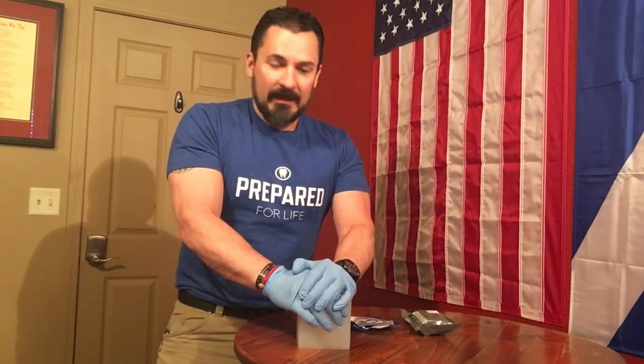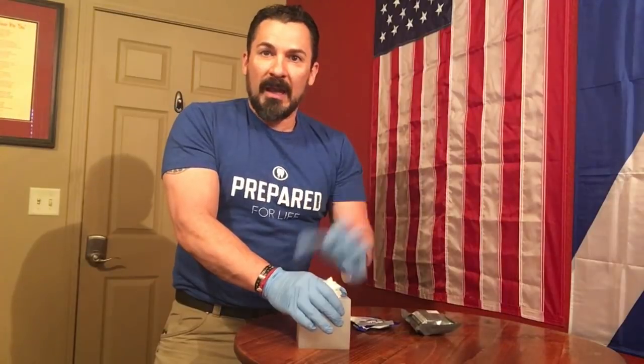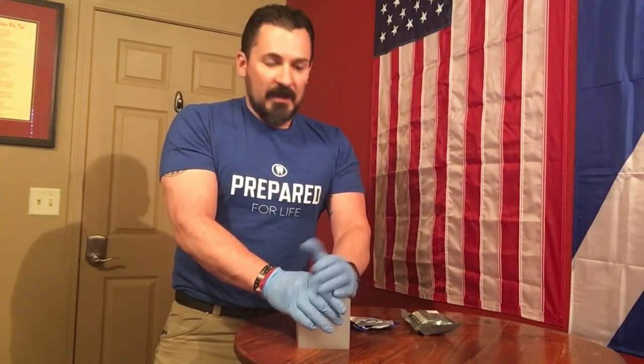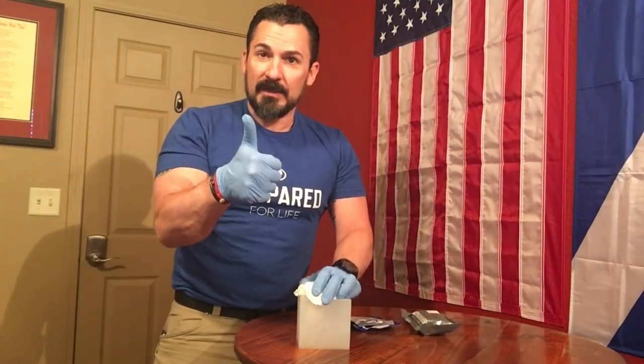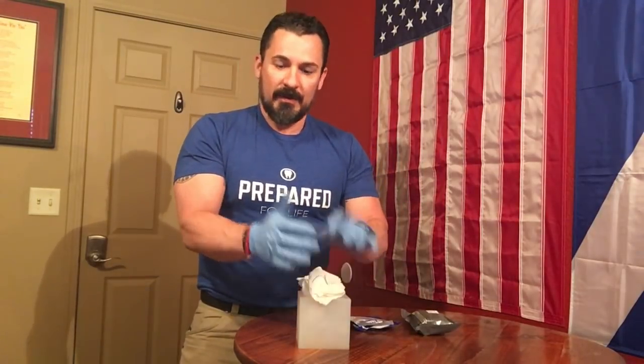That way it'll help hold that nice, big, tenacious clot down in there and hold that pressure circumferentially in that little wound cavity, that wound bowl. That's your key to success with using a hemostatic agent. Good, consistent, direct pressure, and making sure you reinforce it with a pressure dressing. Training is another big key to success with this stuff, because just because you have it doesn't mean it's going to work in a situation when you need it to.